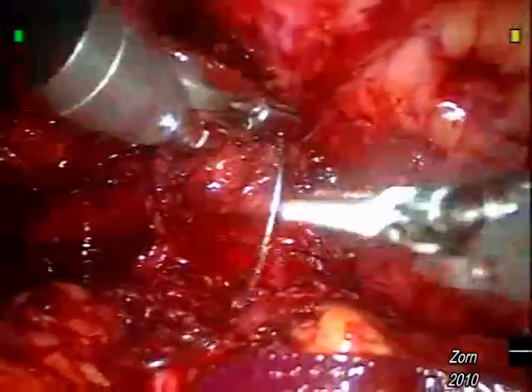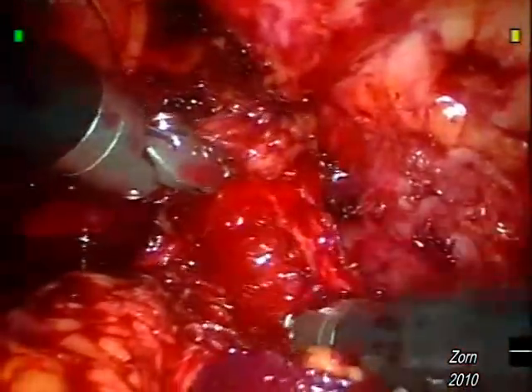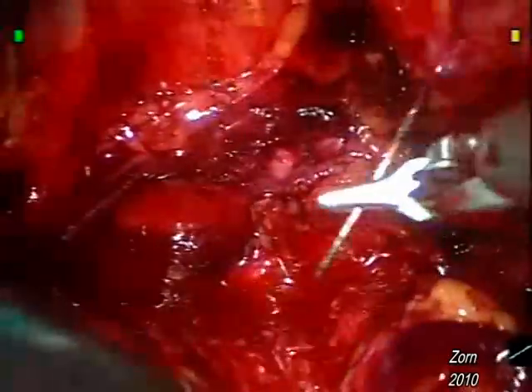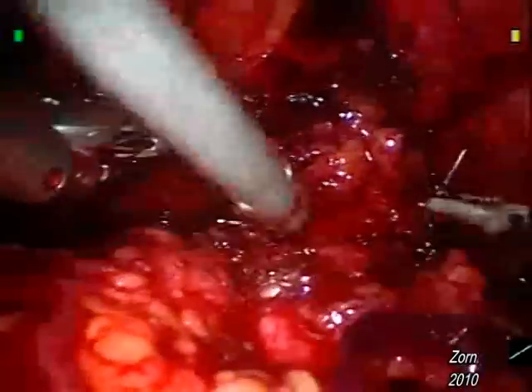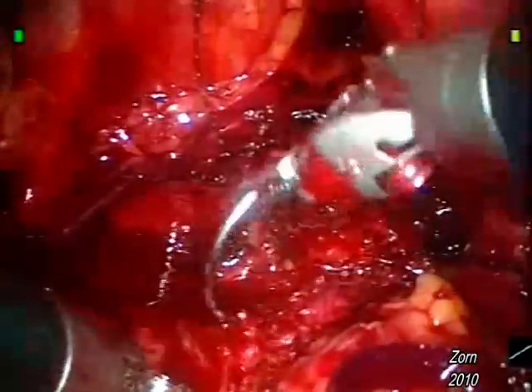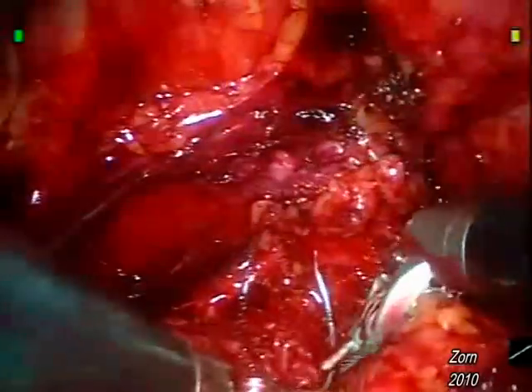Here we can see the final few bites of the right-sided suture with ease of instrument passage. The assistant will momentarily come in with suction to rid the tissue of any blood clots. Here we come back to the left-sided suture, which was left unfinished at the 9 o'clock position. Sutures are similarly placed through the bladder, taken, and then replaced through the urethra.